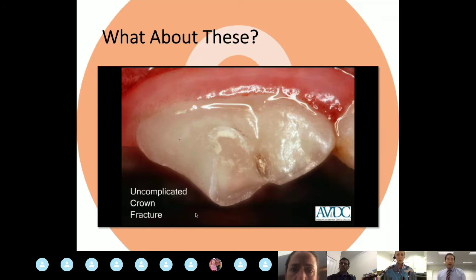And if it is a pulp exposure, you'll see the shepherd's hook penetrate into the pulp cavity itself. Sometimes that pulp cavity can be obstructed by calculus, and what I'll often do is use the tip of my ultrasonic scaler on a low power setting and scale around the suspected pulp exposure, and if I can keep chipping away at it, that typically means that's a pulp exposure that's filled with chronic calculus formation. But when you do identify a true uncomplicated crown fracture, it's important to tell the client that these can potentially cause problems depending on a variety of factors.